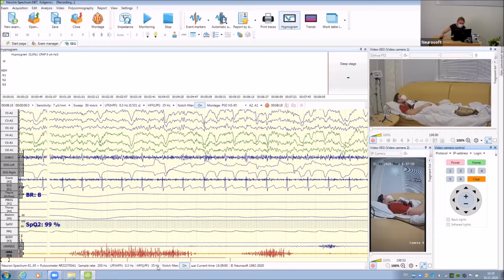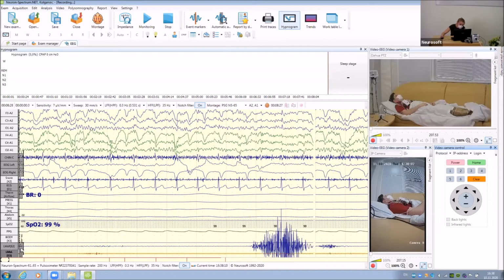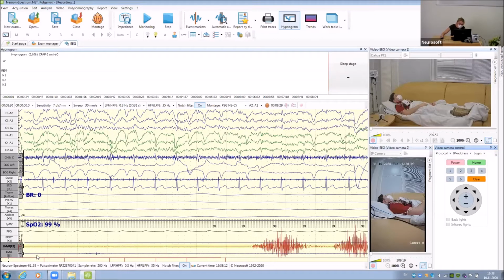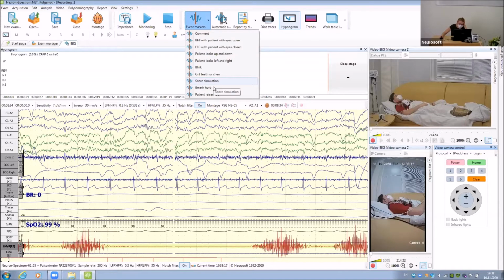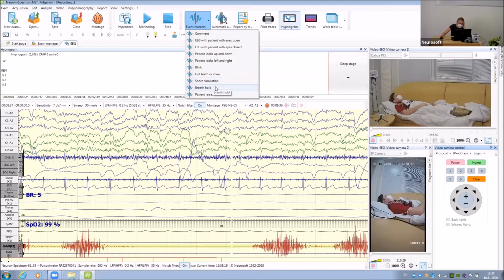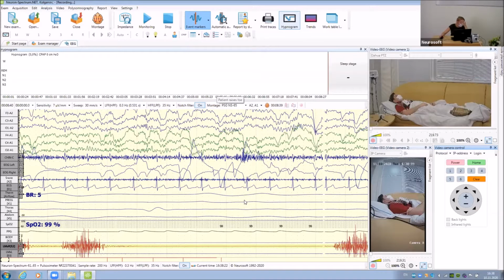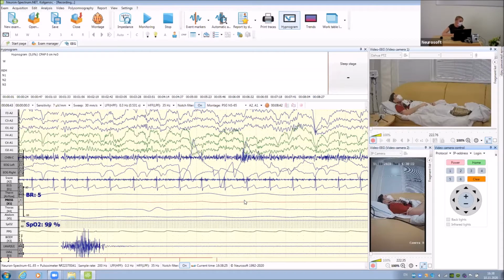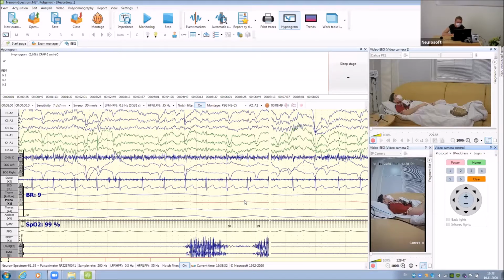So now we ask our patient to raise their toe of their right foot. Okay, very good. So very, very high amplitude. Thank you. And now we ask the patient to repeat these maneuvers with both feet. So we have a bipolar EMG event.